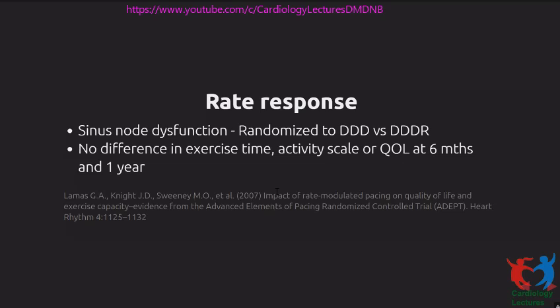Whatever trials have been done of DDD versus DDDR have not really shown a huge benefit of adding rate response to DDD. So I would say the main place where you can consider a DDDR is if you're going to use a dual chamber pacemaker in a patient with sinus bradycardia who has chronotropic incompetence. So the patient typically has resting sinus rates of 40, and with effort the rate doesn't go up beyond say 50 or 60. So you want them to pace in the atrium and their atrial pacing rate to go higher when they exercise, then definitely give them a DDDR pacemaker.